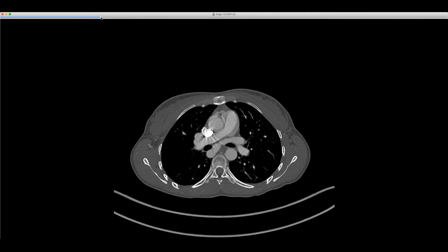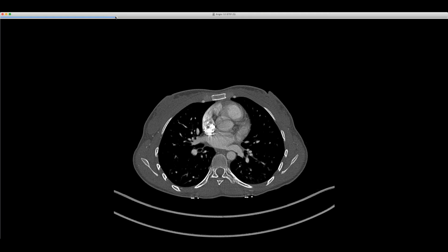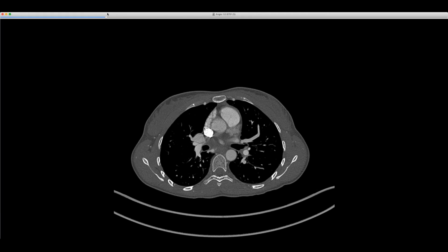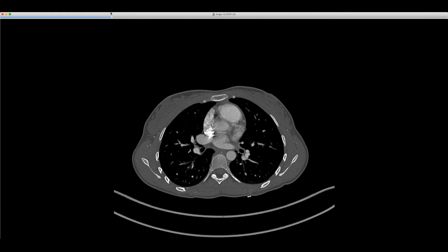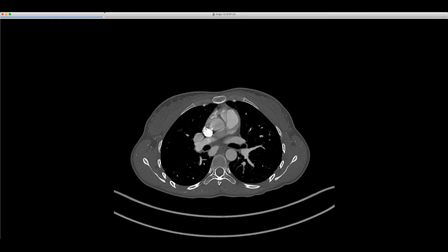And usually the top pulmonary veins that we see come in about right here, and they come, as you said, behind the bronchus intermedius. But this goes into what would be the superior pulmonary vein. I've never seen this, and I just thought it was especially dramatic.